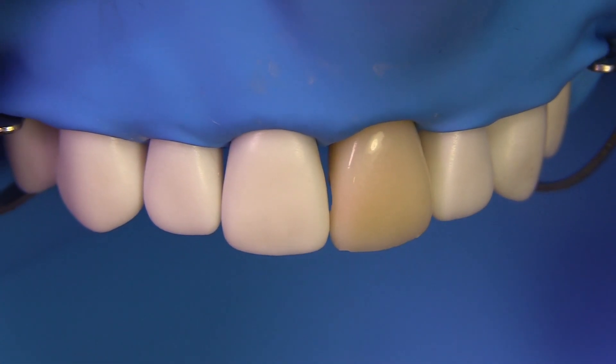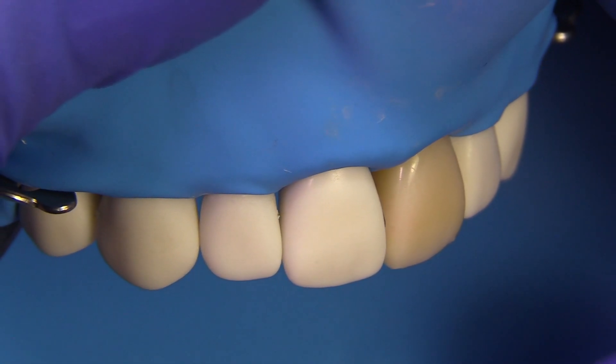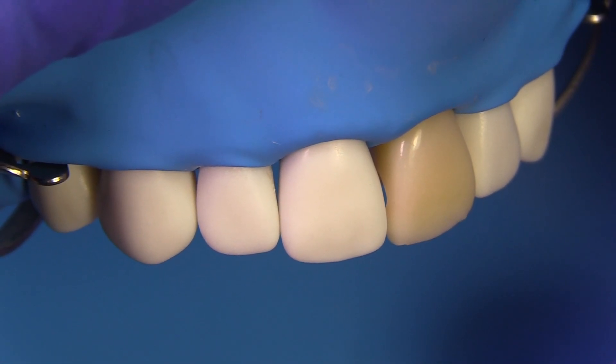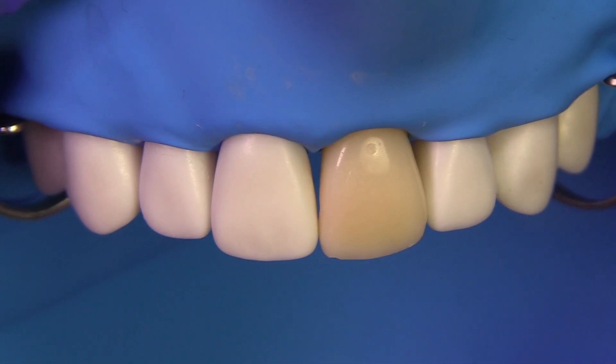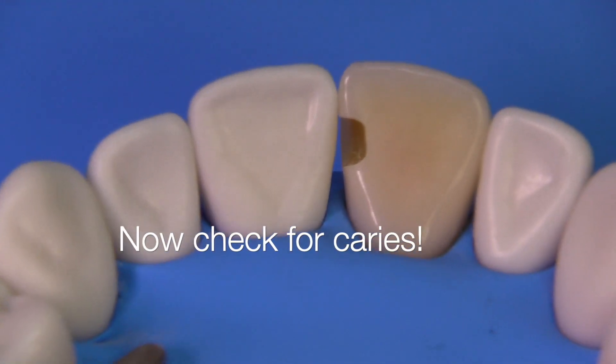Looking at this from the facial and turning slightly to the side, you can see light through that area — and this is important. You really have got to get your extensions facially to the point where they are visible from the side. Now let's look for caries.